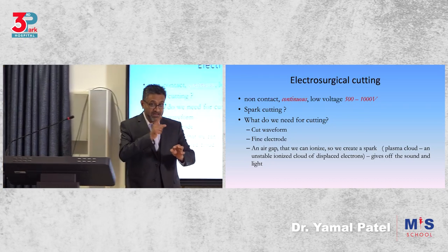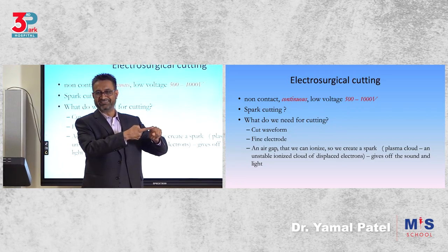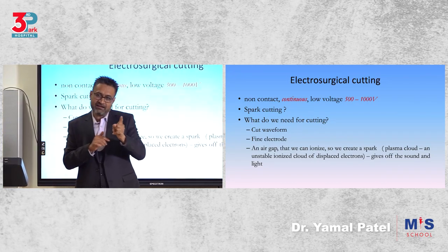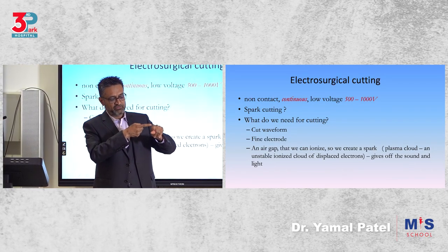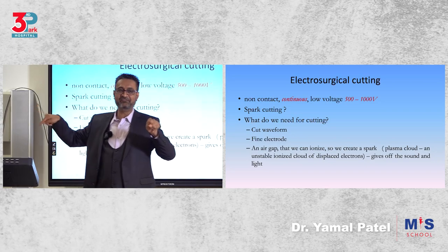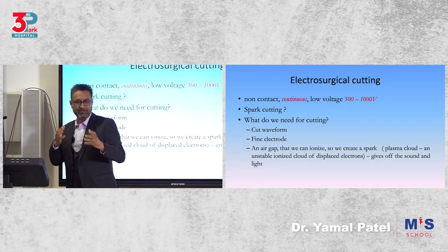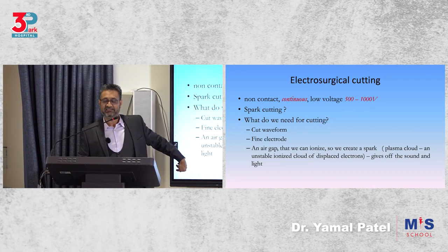So when you want to cut well in myomectomy, you don't touch the electrode and then activate, because then you're desiccating. So if you want to cut, or let's not use the word cut, because we are mixing cut effect and cut mode, let's say you want to vaporize. So when you want to vaporize, you leave a small gap, activate it, the yellow, touch, and now slice like a knife. You'll see it will cut very nicely. Whereas when you touch and activate it, it will stick as you're going. You get the difference? So if you want to cut nicely, give a gap, activate, then slice. Okay?